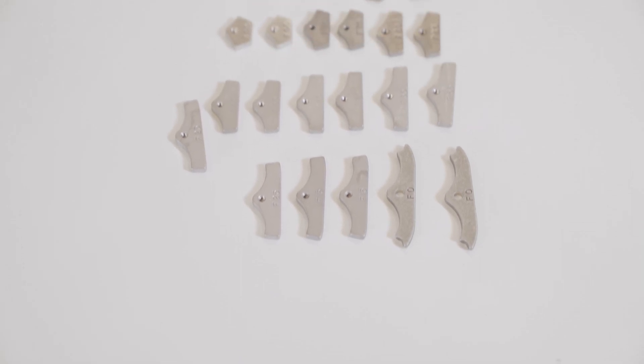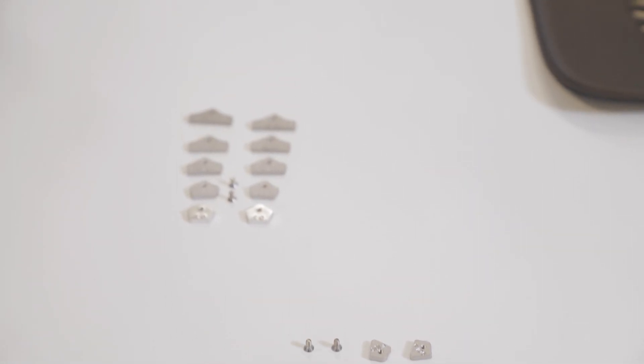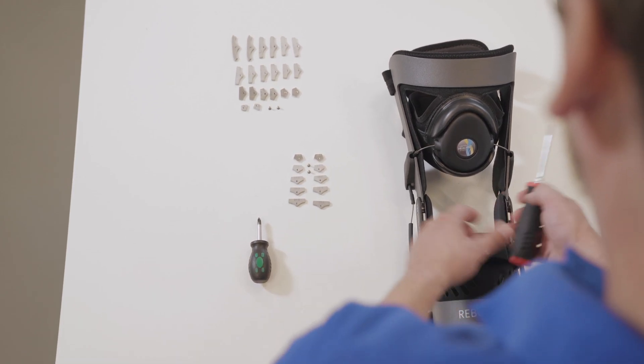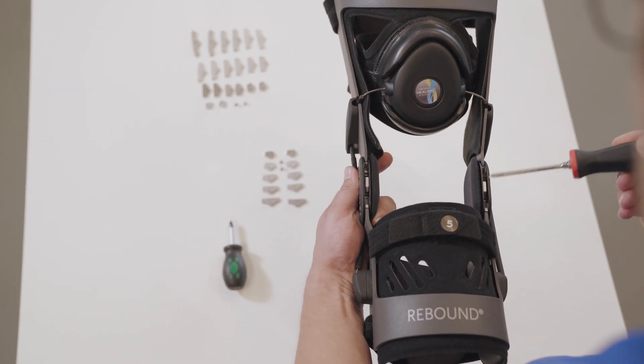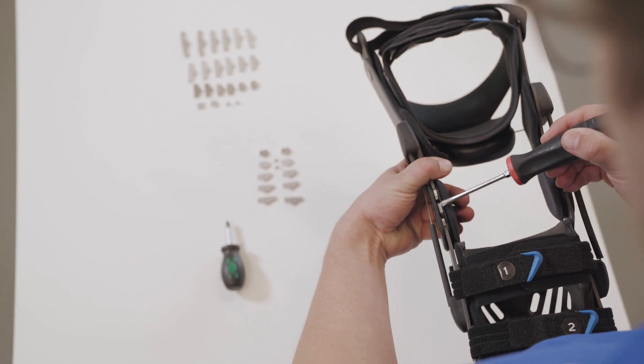To suit individual patient needs, range of motion control can be adjusted using extension and flexion stops. The brace comes pre-installed with 90 degree flexion stops and zero degree extension stops.